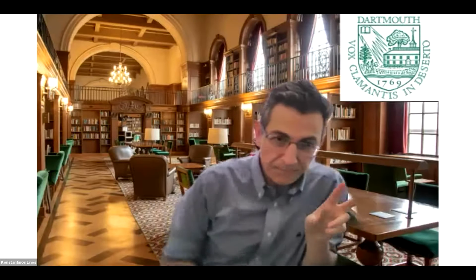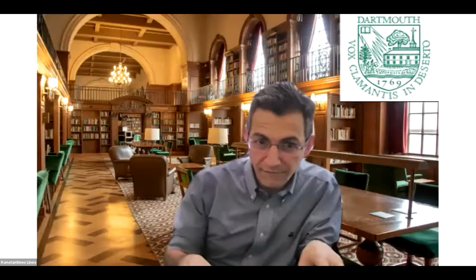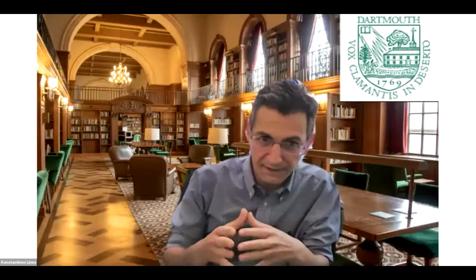I just want to mention two things. I don't want to sound arrogant, but the two stains that I have never used in my career as a pathologist are Vimentin and BCL2. I've never used these stains, but people use them. But I'll tell you, never use Vimentin.